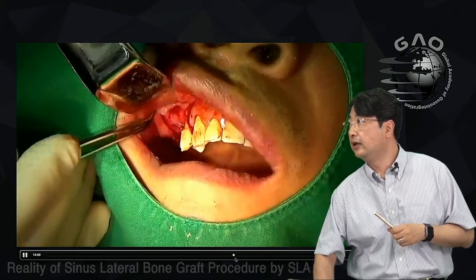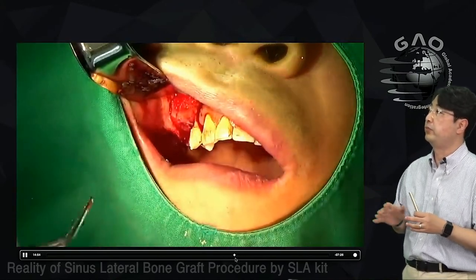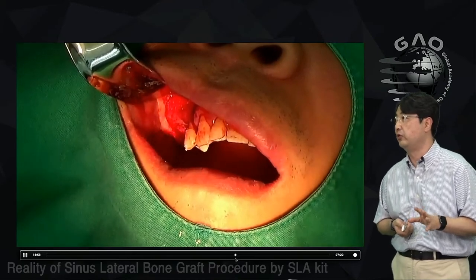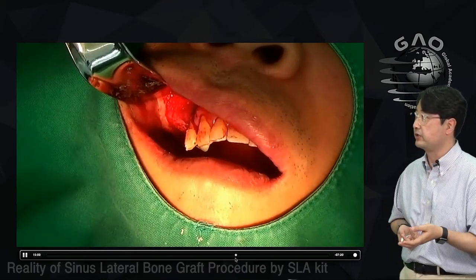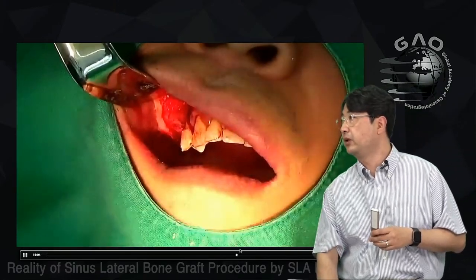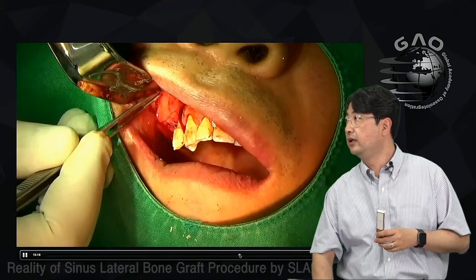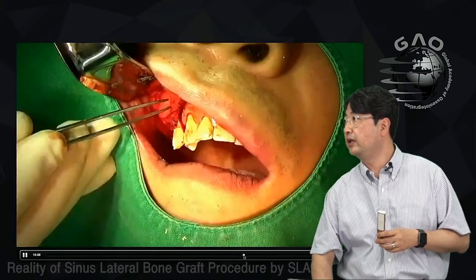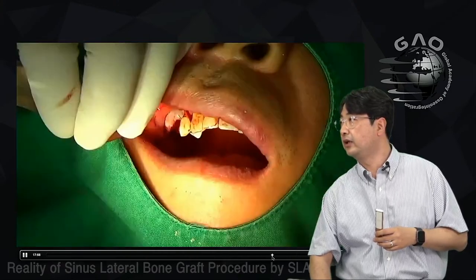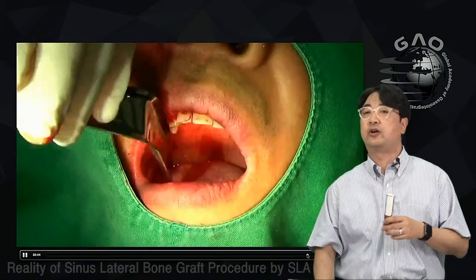Then I cover the anterior opening with the PRF membrane. And in this case, I haven't created the window. The window was already there. So I covered it with the PRF membrane because it was too big, right? Then I placed the PRF membrane. Then I made sutures to close the wound. So this is how it worked.